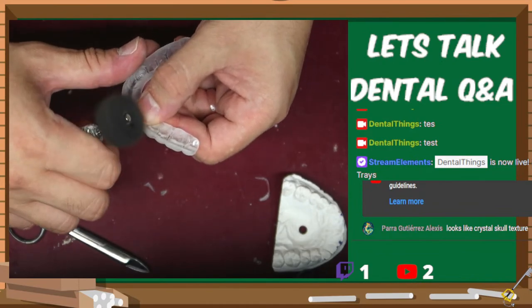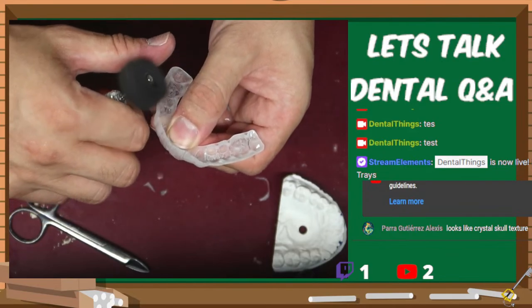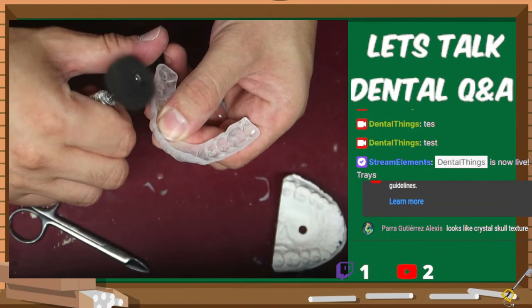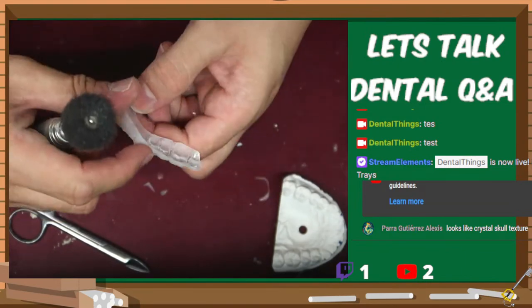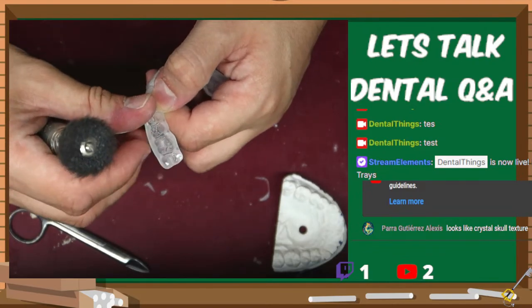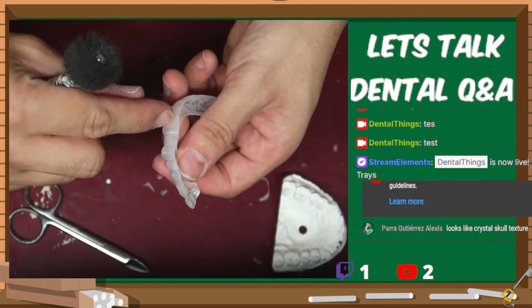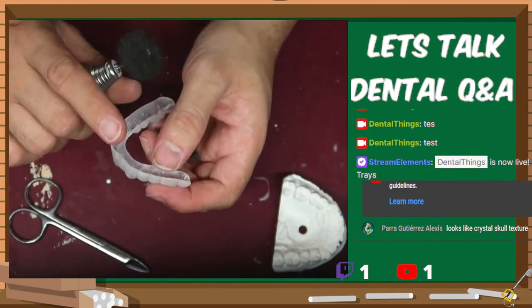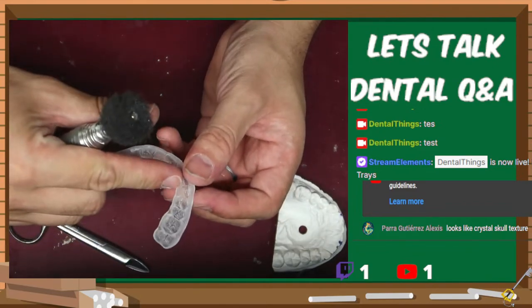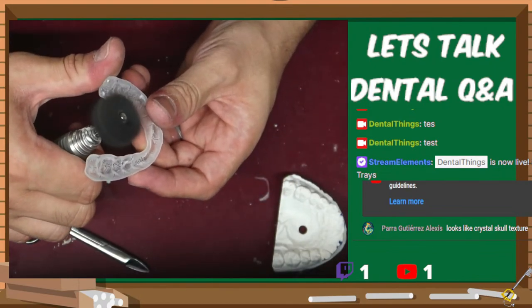And as I finish up these edges of the teeth, I can put it back on my model and just inspect how my cuts were, how it looks now, how it feels. You always want to have a nice feel. See if there's any rough spots, any hard spots, especially if you're making one of these as a retainer, a hard plastic, then you really want to make sure that it doesn't poke anywhere. Because your patients are not going to like that at all. Little spot right there can use a little bit of touch up.